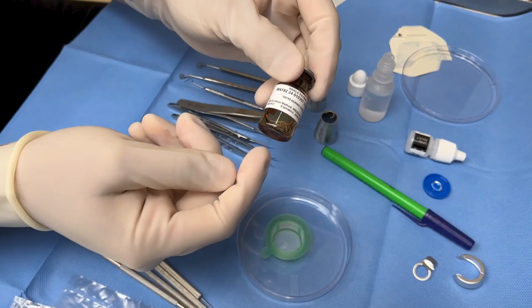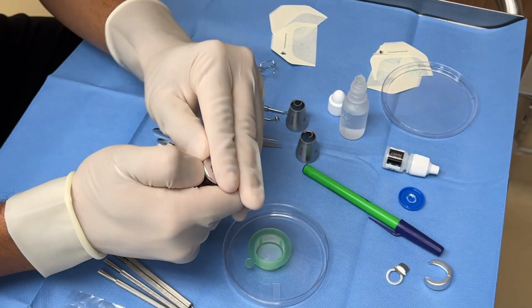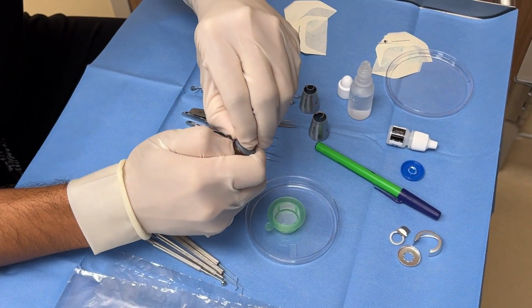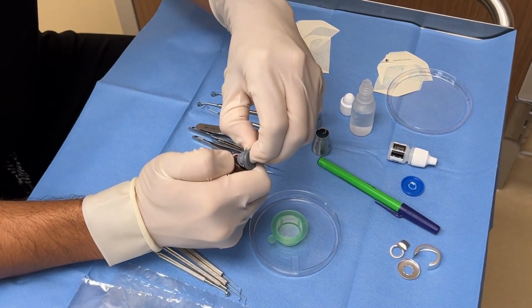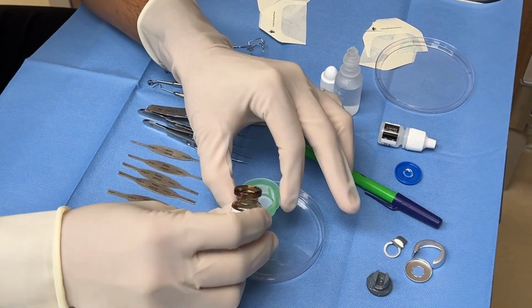So you're going to receive that here, with a couple of little pearls. The first thing is that as it comes in the medium, these things are transparent and small, so you want to make sure that you don't lose it. It may be on the back of the cap, on the inside of the cap, or stuck to the inside of the bottle. So you're going to decant this into the strainer that's going to come in the package.